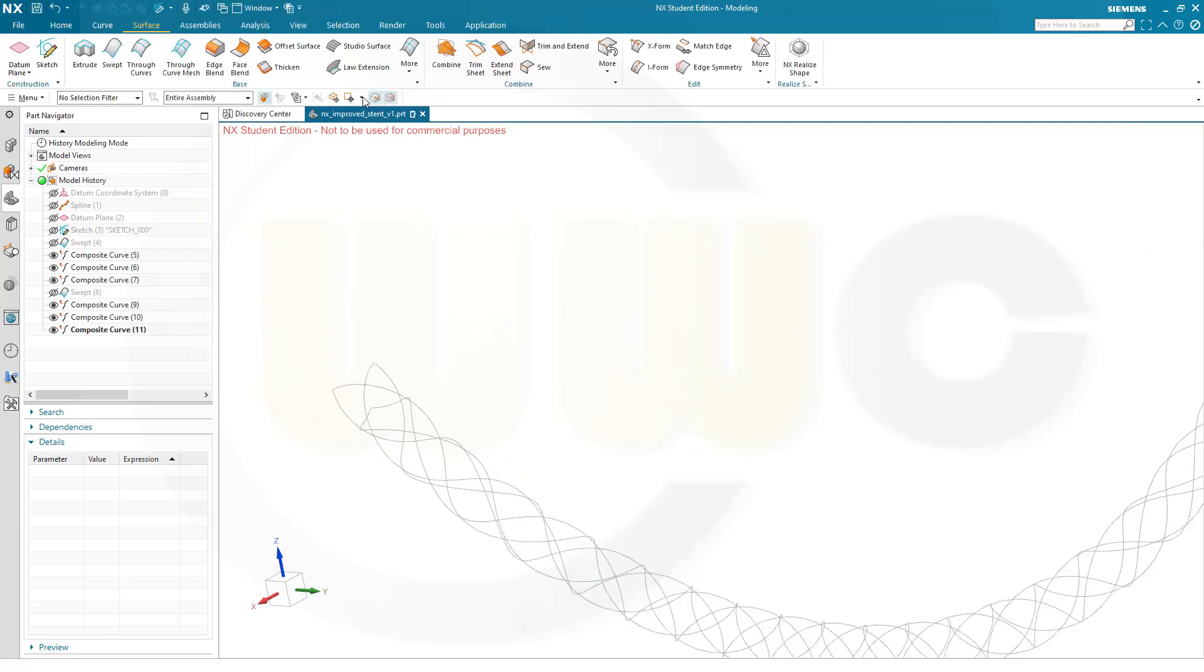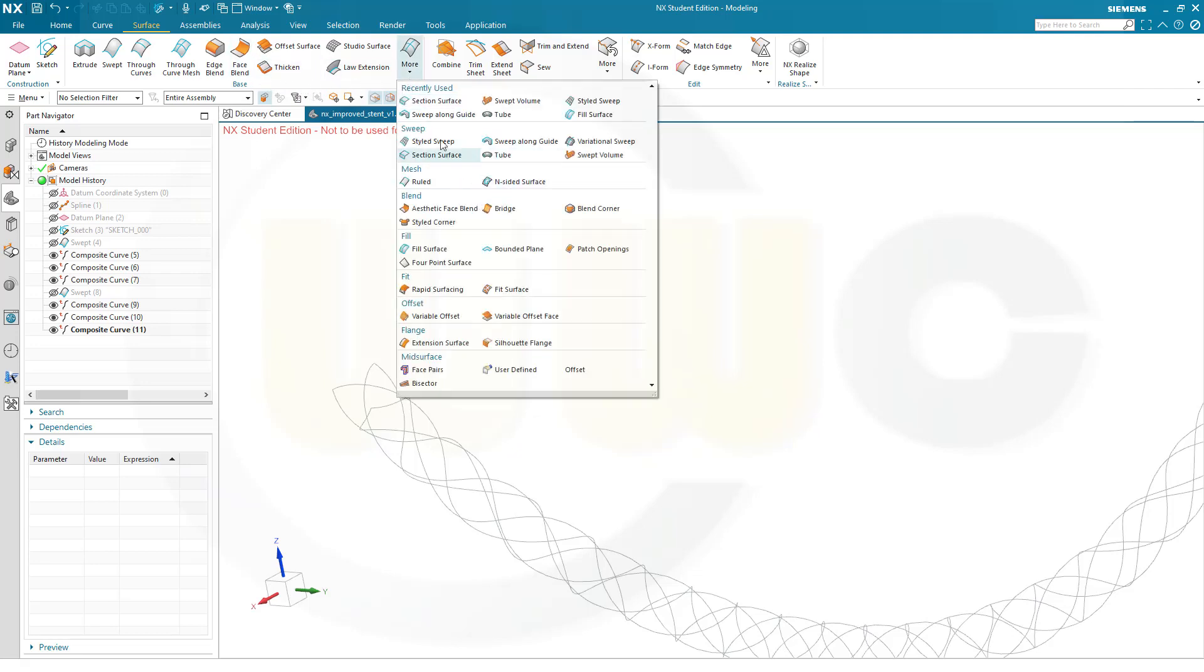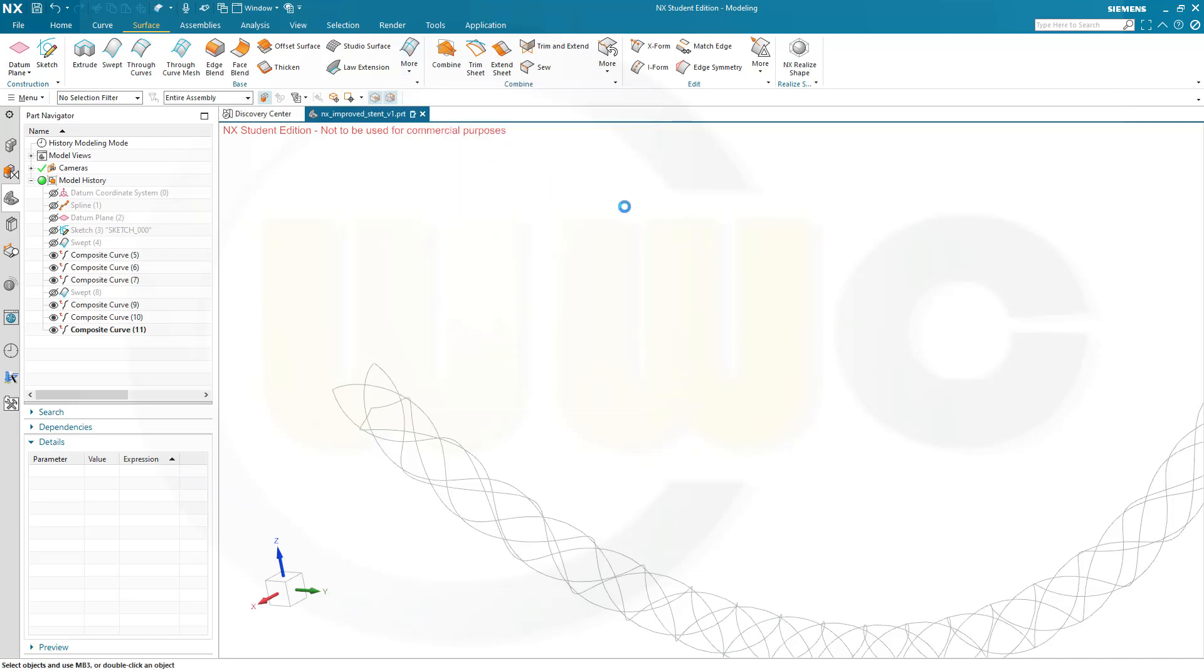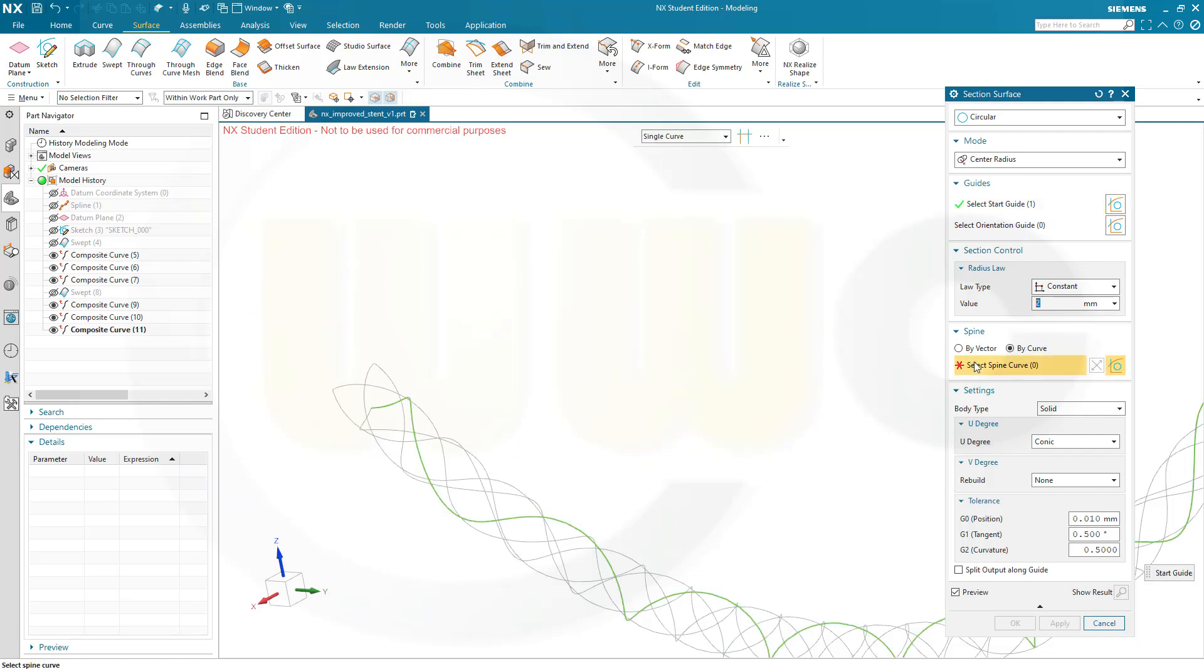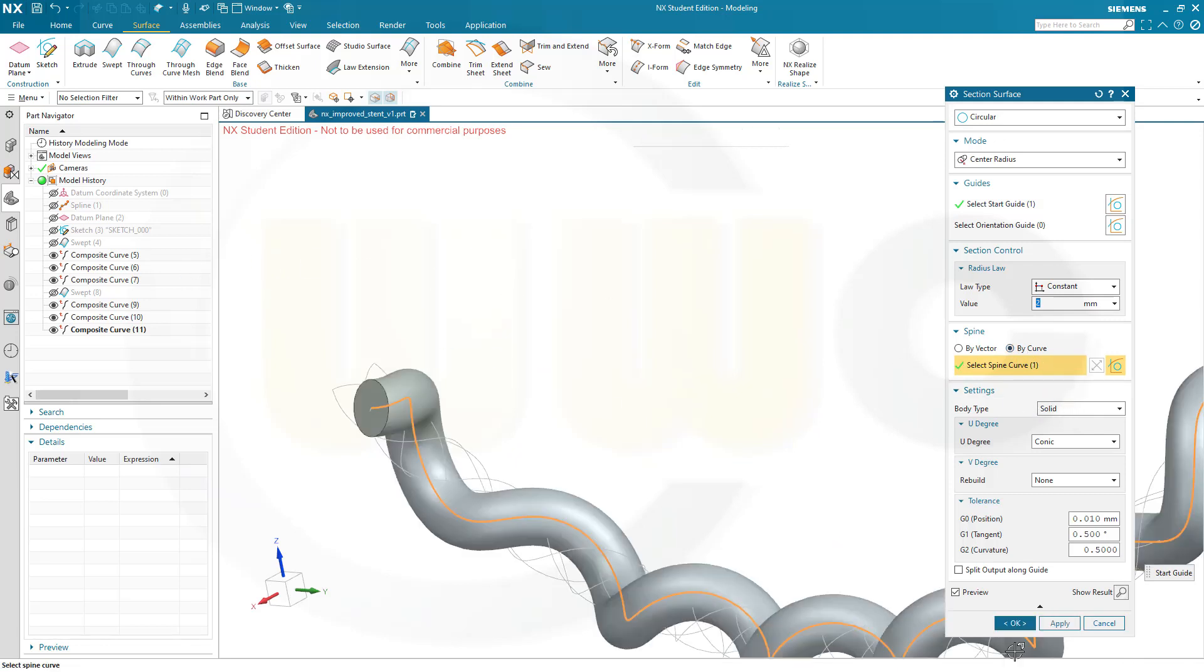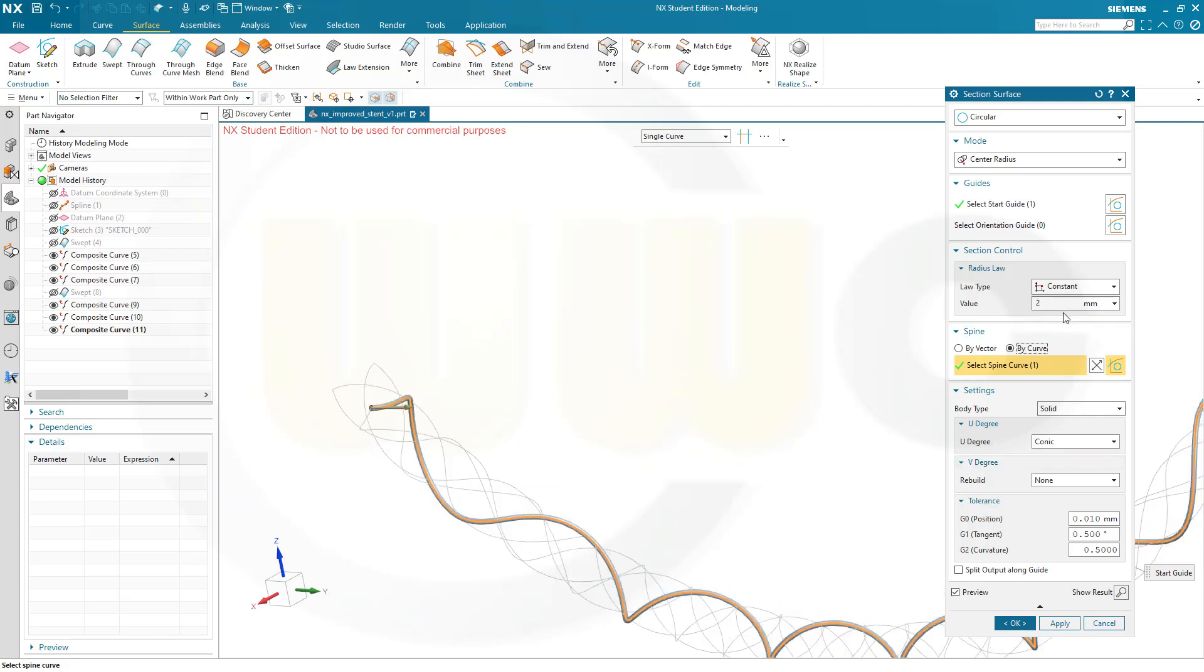Let's add a section surface. Section surface, there you go. Circle one, and I want to go for a 2 mm radius, constant. And the guide would be the first composite curve, and the spine would be the same. And please note it's a pipe curve and I want to have a solid. And that's obviously an old value. So, apply.